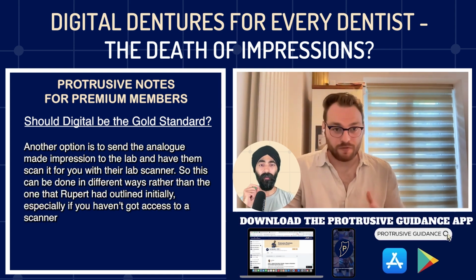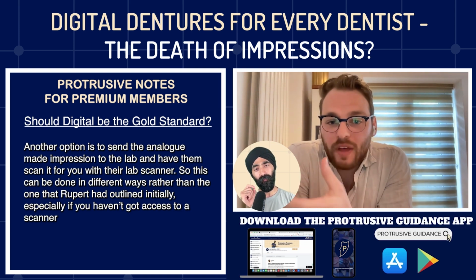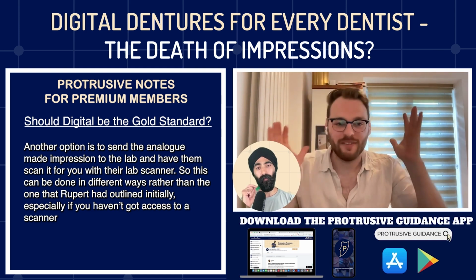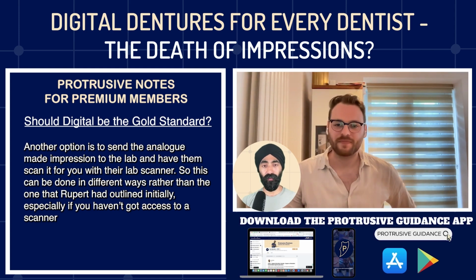But even for yourself, if you don't want to scan it, you can send it to your lab, and most labs now have a lab scanner, so they can scan it for you. So you don't even need to own a scanner, but you could still do digital dentures as well. So yeah, there's a million different ways. The scope is so vast.